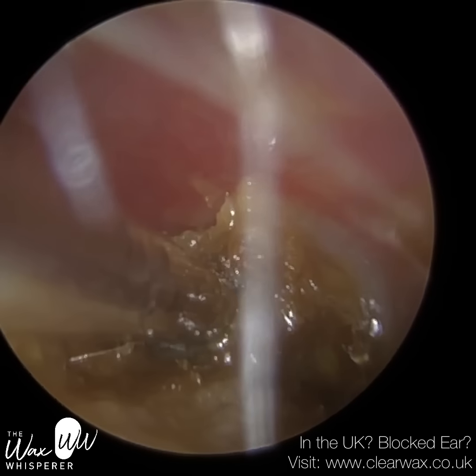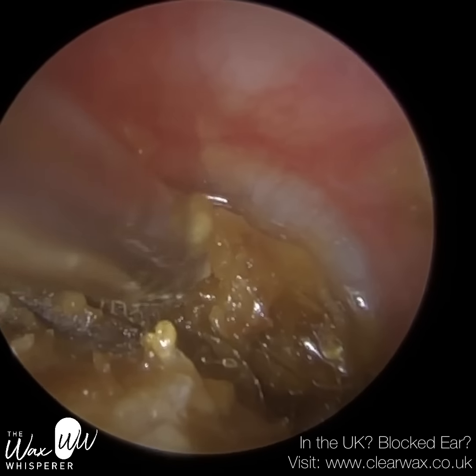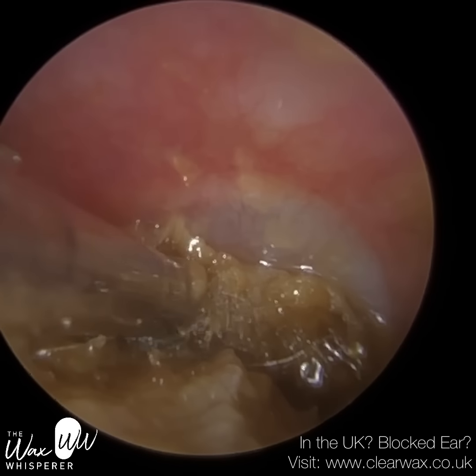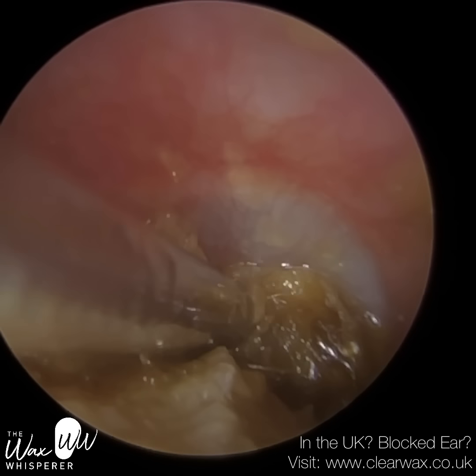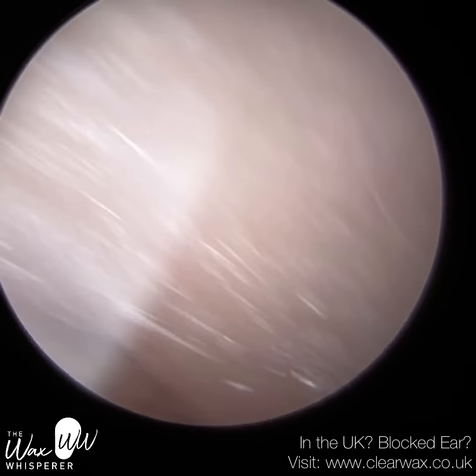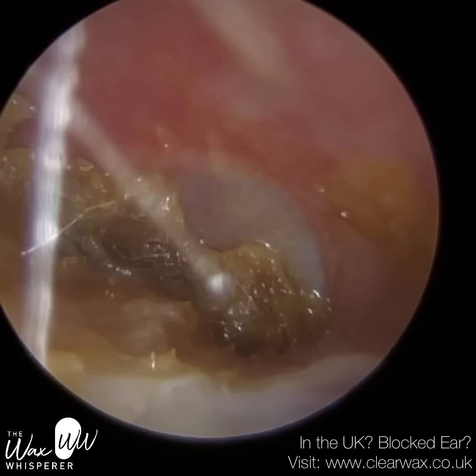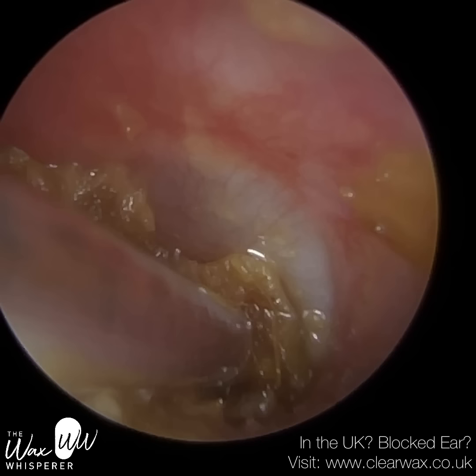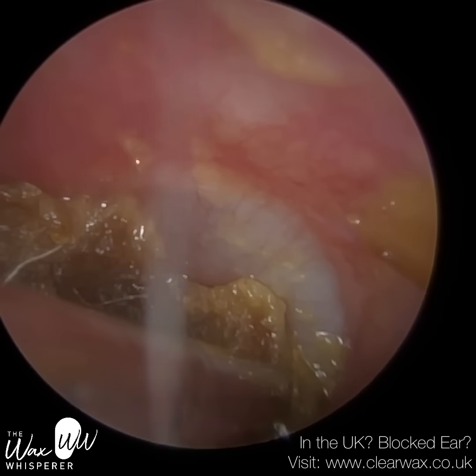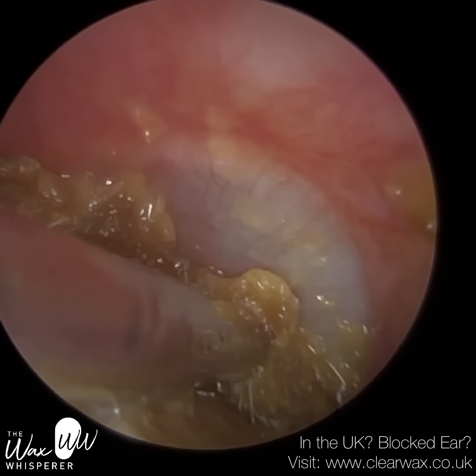Previously, I put the oil into the ear, let it soak for a few minutes, then request the patient to tilt their head in the opposite direction so we can drain the ear of the oil, and then go back in and continue. But now I ask the patient just to tilt their head so the ear with the oil in is facing towards the ceiling. I then get off my ENT chair, stand up looking down into the ear, and suction the wax and skin with the oil in. I find that's more effective, though it can be trickier because suctioning also pulls the oil, causing some blurring at the tip of the endoscope lens.